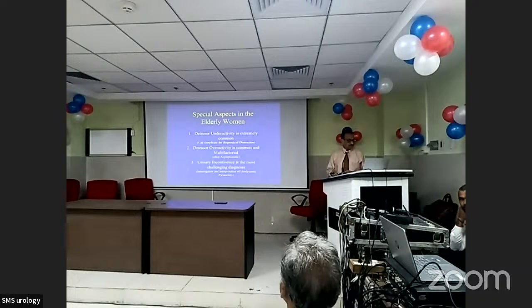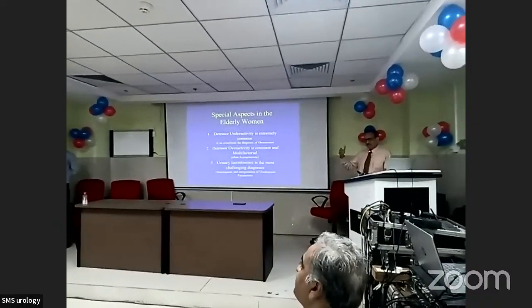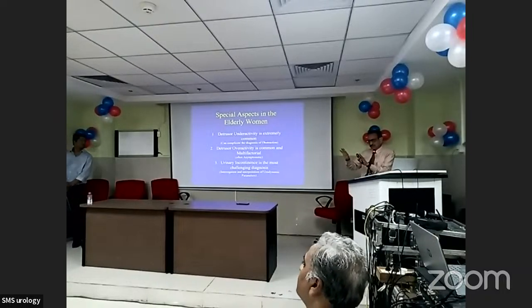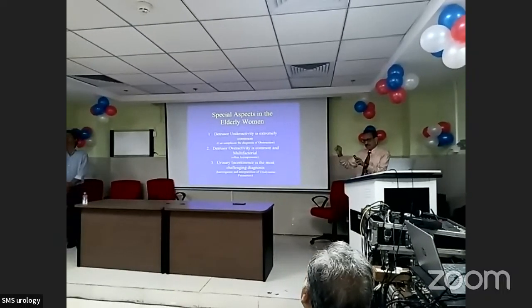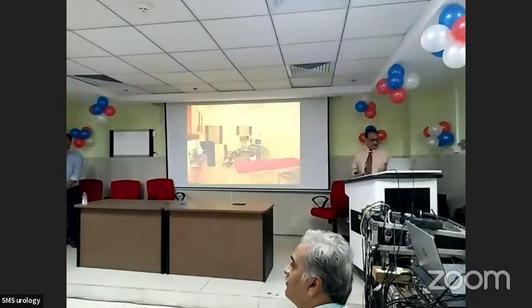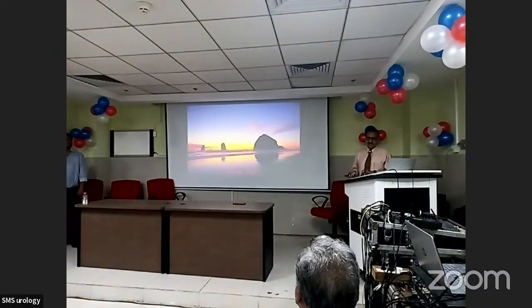Urinary incontinence is the most challenging diagnosis because you need to really understand, do urodynamics very carefully, and talk to the patient continuously while doing urodynamics, interactively, which you'll see in the video. That is how you can dissociate all these phenomena from one another and make a precise diagnosis of incontinence. In the video, this is a urodynamic laboratory, which is one photo that I normally show. And thank you so much.